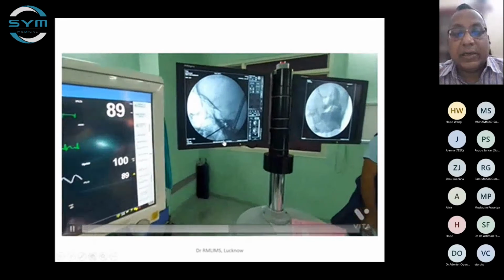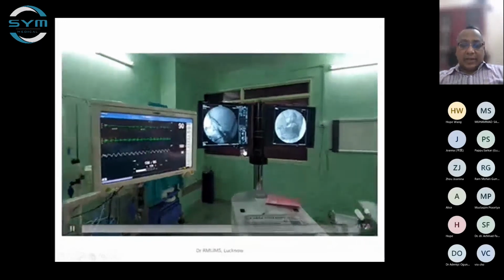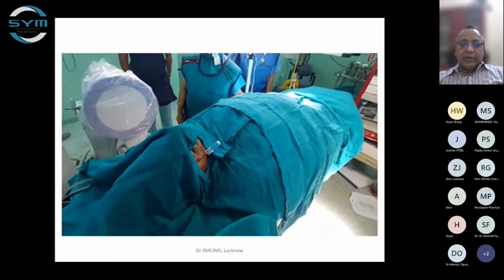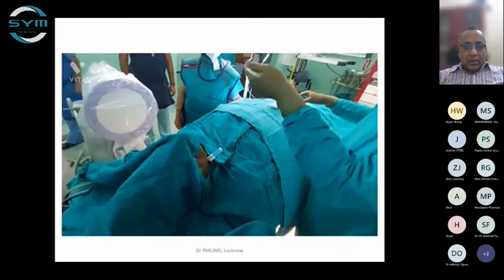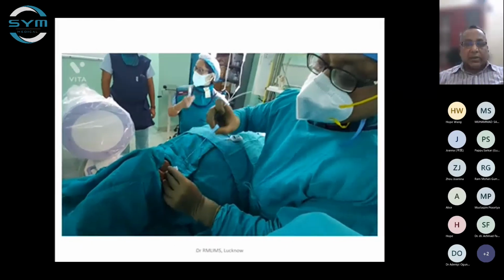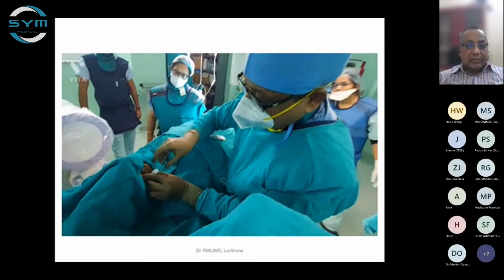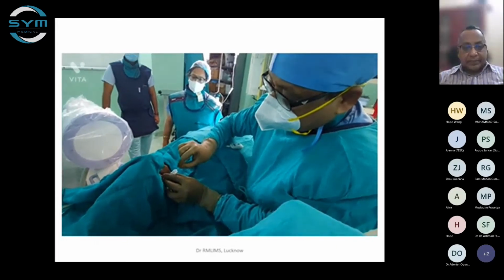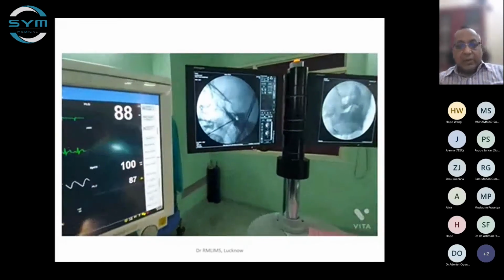Now you can see that this guide wire, or you can say the dilator, has passed through the cannula. In the same place we will insert our 4 French specialized balloon catheter. This balloon catheter also has marks to see the depth. The first mark signifies that the tip reaches the tip of the cannula. The second mark goes almost 1 inch ahead of it. That is the place we usually intend to reach while doing the percutaneous procedure.